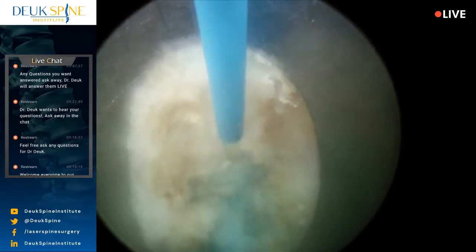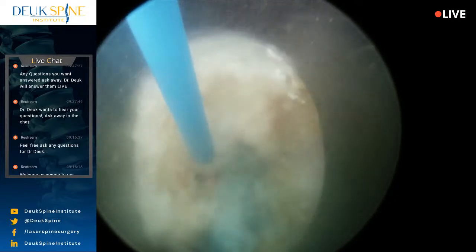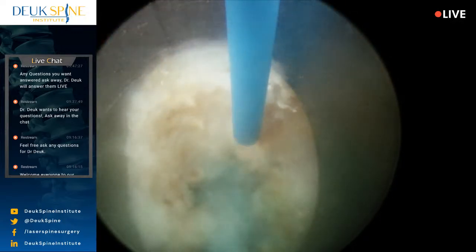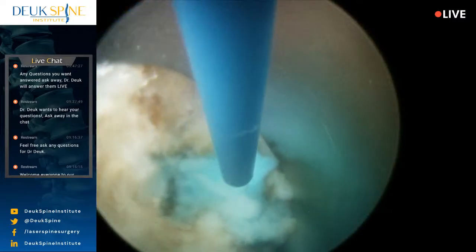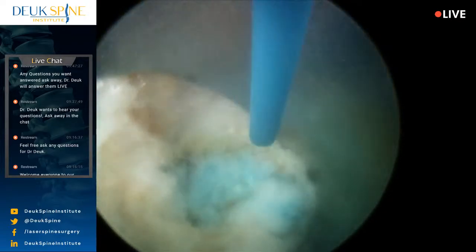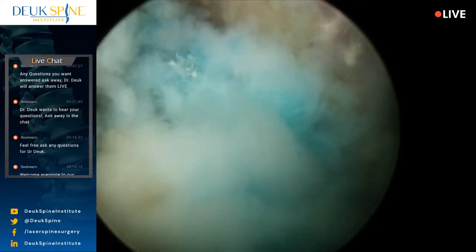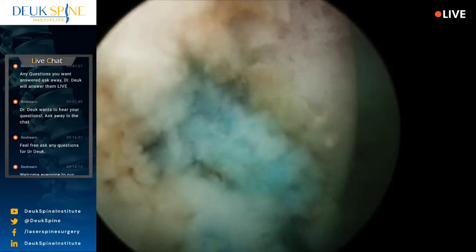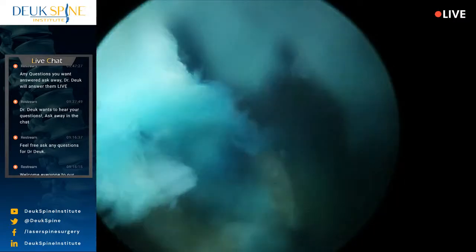Look at this beautiful laser. It's removing the degenerated disc, which is the blue stuff, the herniated disc. It's cleaning out the scar tissue. This is all scar tissue here, from an injury to this disc. Over there, that pink thing is the end plate of L4. Look at this. Now, when I put the dilator through the tear, it actually pushed herniated fragments into the disc itself, pushed them back from the neural foramen where the roots are, where they were interacting with the nerve roots in a way they shouldn't be. So now we're going to release these herniations and pull them out.